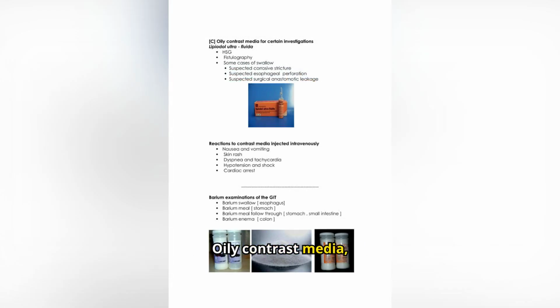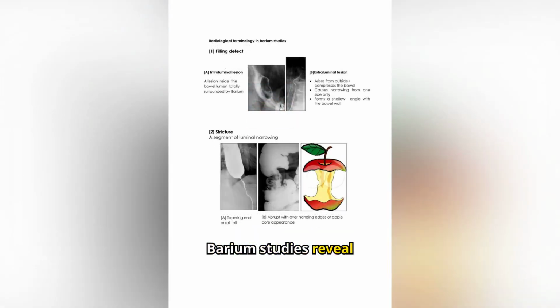Oily contrast media, such as lipiodol ultrafluid, are specialized for certain investigations, providing detailed visualization in procedures like HSG and fistulography, enhancing diagnostic accuracy. Barium studies reveal radiological terminology like filling defects and strictures, helping identify intraluminal and extraluminal lesions, crucial for diagnosing gastrointestinal conditions and planning appropriate treatments.